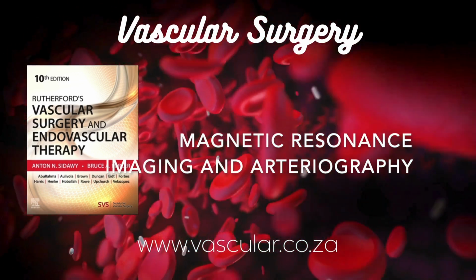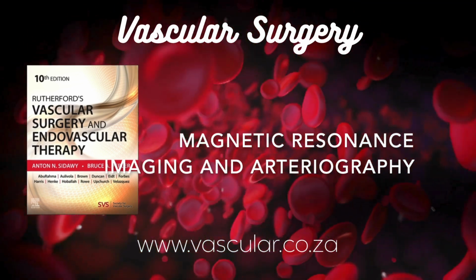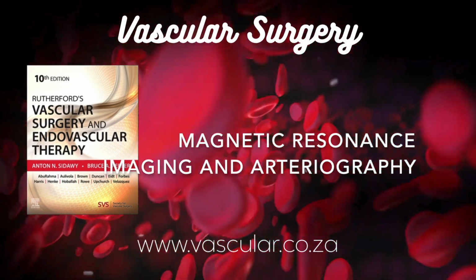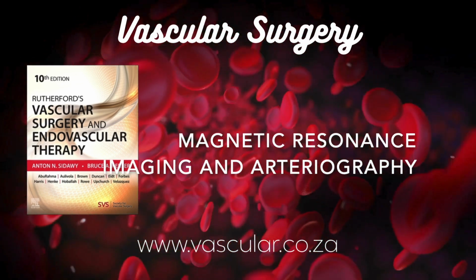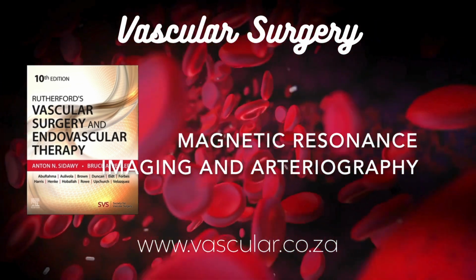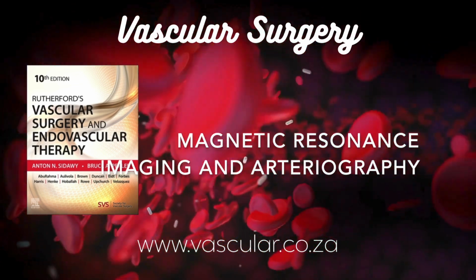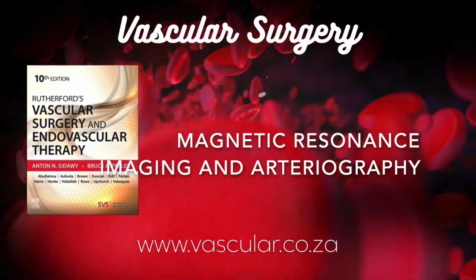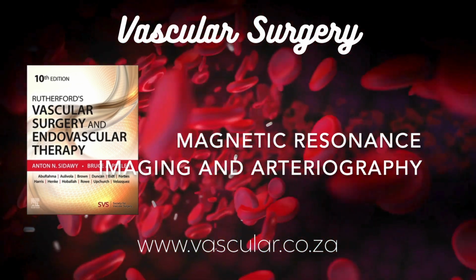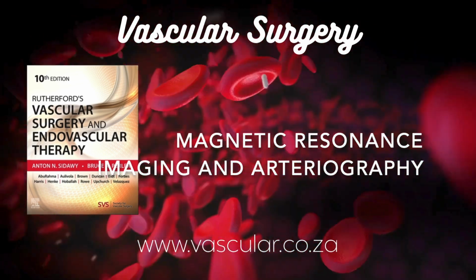What about directly imaging blood flow, not just the vessel structure? Right, beyond just seeing if a vessel is open or closed, phase contrast MRI can actually measure blood flow velocity. 2D versions are used routinely in cardiac MRI. And in 3D, that's the frontier, 4D flow MRI. It measures velocity in all 3 directions, evolving over the cardiac cycle. Imagine getting detailed 3D flow maps showing swirls and jets inside an aneurysm. Wow. Clinically useful yet? It's getting there. The analysis is complex, and it's still mostly a research tool, but the potential to understand hemodynamics non-invasively is huge.